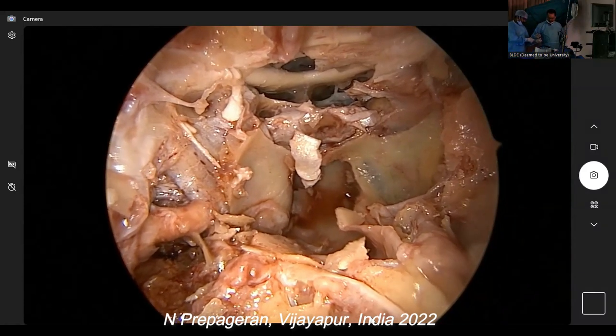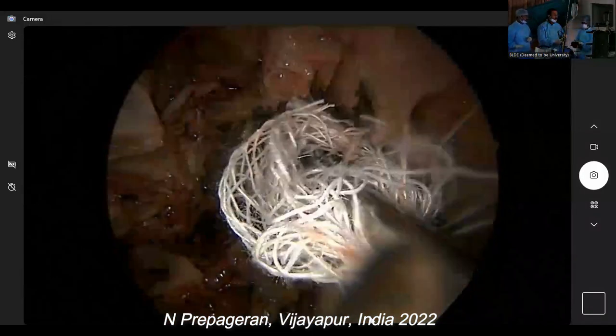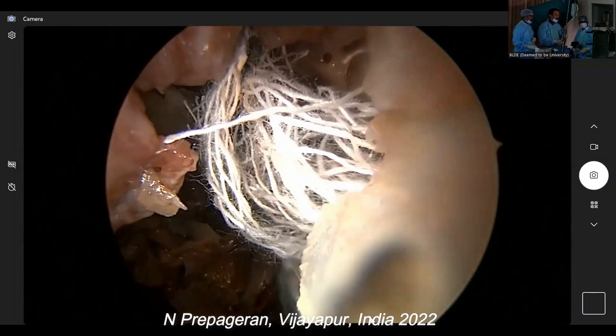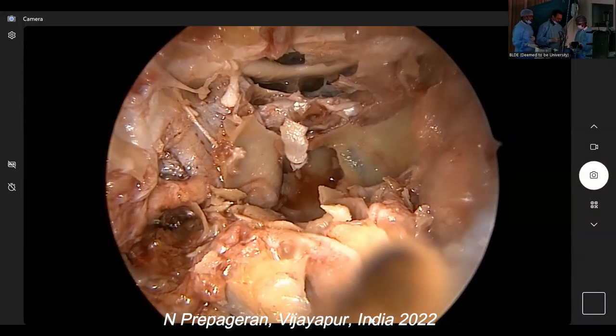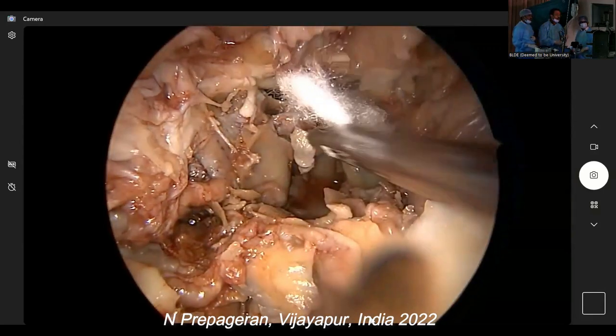So you take a piece of fat. Piece of fat. Oh, it is better. Thank you. Give me that. Remember I was telling you, do your dissection like how we do a real surgery? Okay. Yeah, that's fine. Thank you. So we've got an artificial dura of fat.